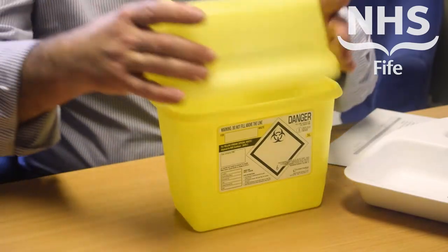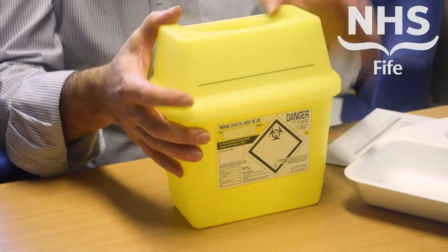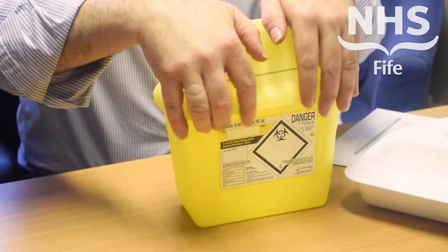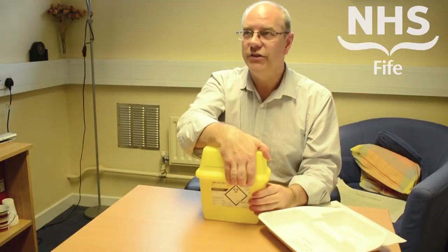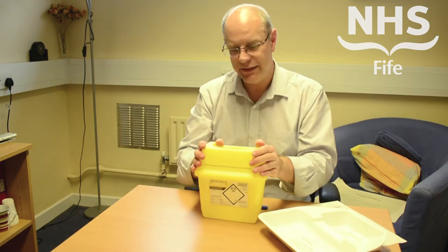A key point with assembly is, when you're putting the lid on, make sure the lid is locked in place securely. A good point in practice is to press it down at all four corners so that it's properly locked. Then give the lid a gentle tug to make sure that it's fixed in place.